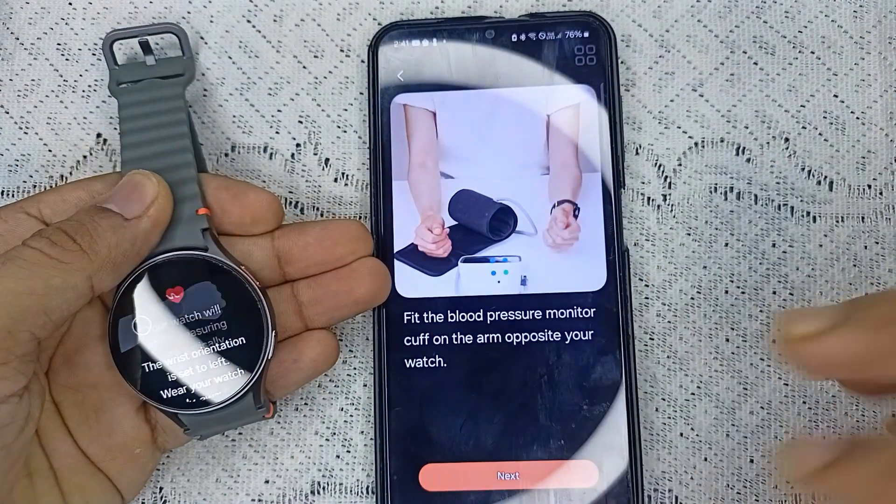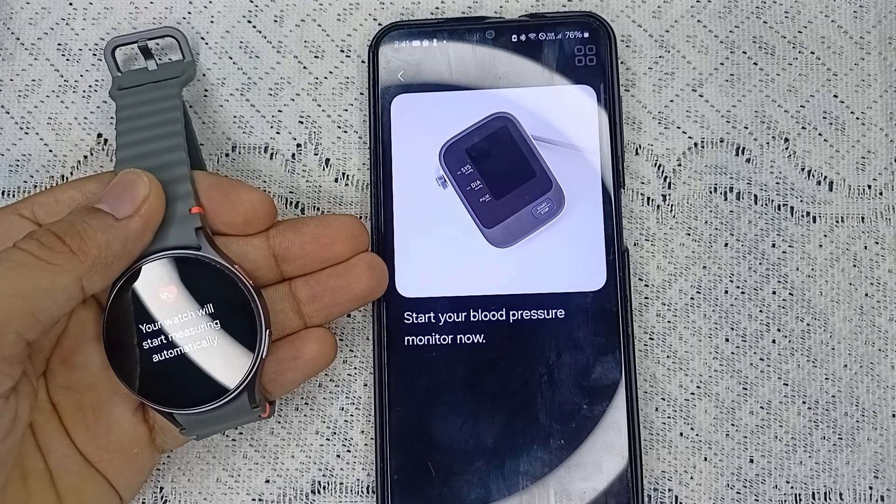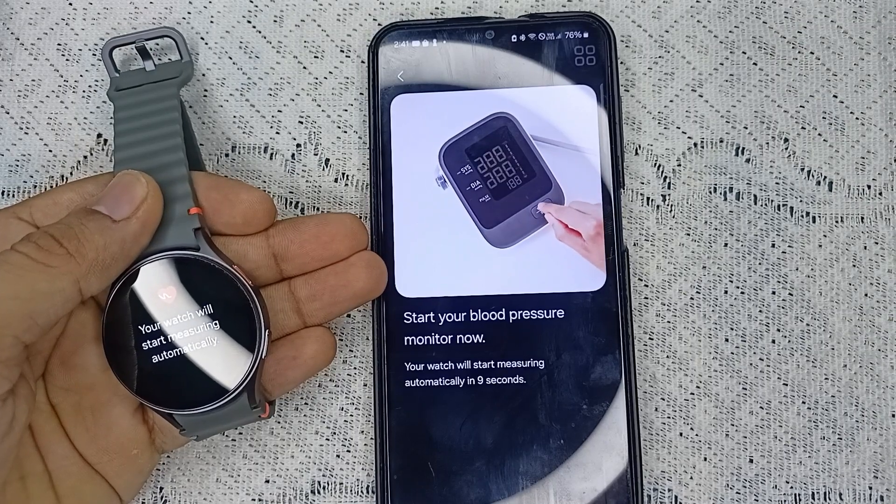Fit the blood pressure monitor cuff on your arm and click on next. The device will now start measuring automatically.